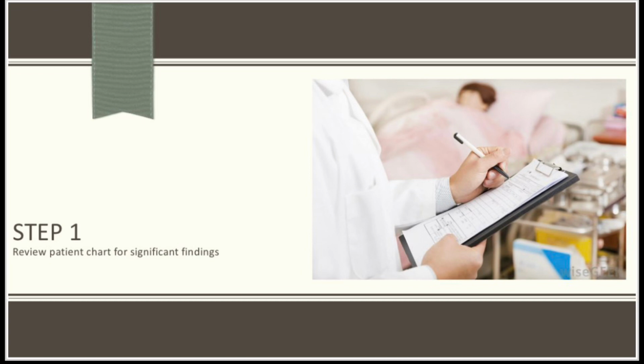The first step in taking vital signs is reviewing the chart for significant findings. Here you can find if the patient has an underlying pathology that would relate to an abnormal vital sign, or if the patient usually has normal or abnormal vital signs.